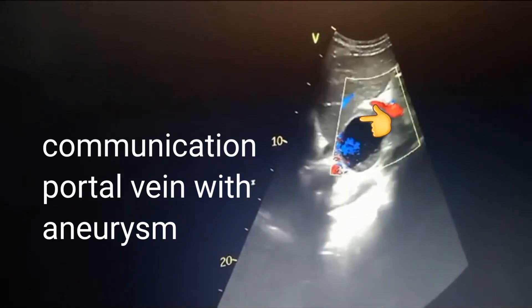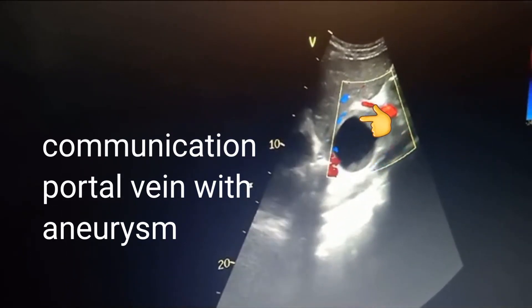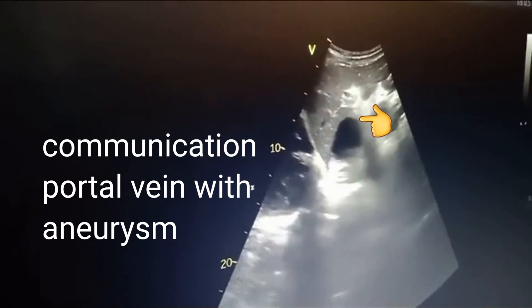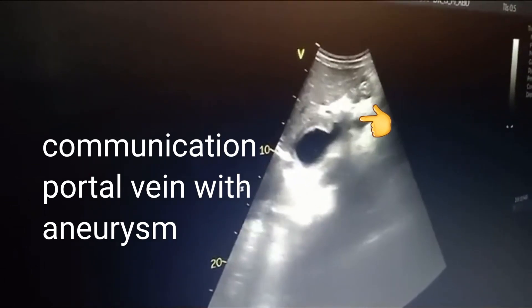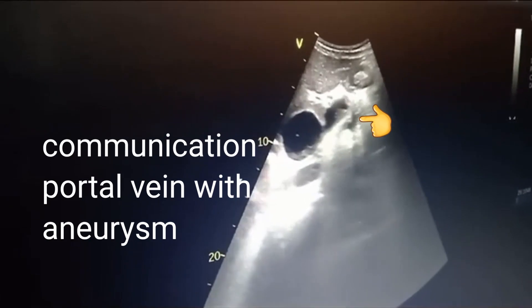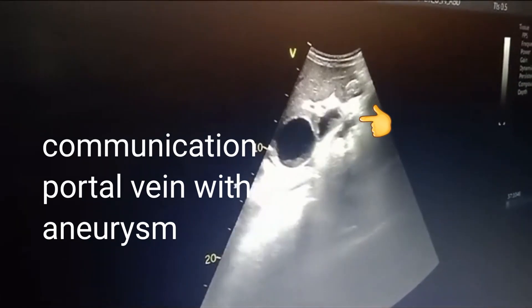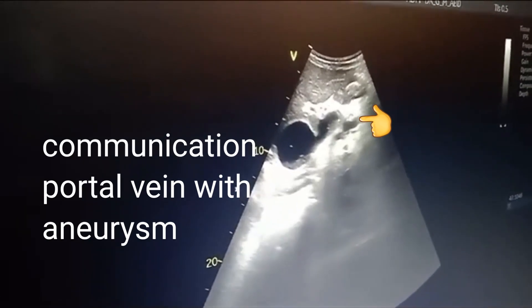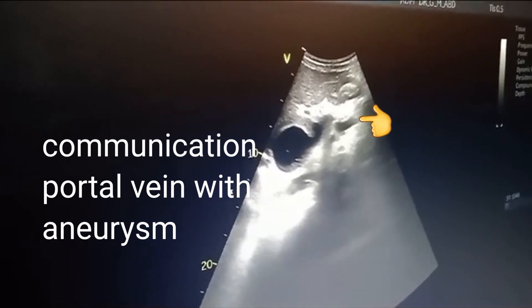Now we can see a communication between the portal vein and the aneurysmal sac. This rules out the possibility of a pseudocyst of the pancreas, which is also a possible differential diagnosis in this case.